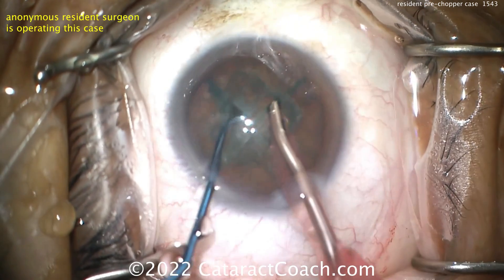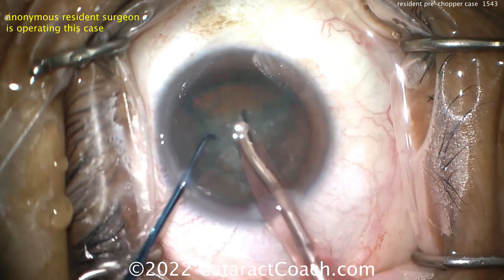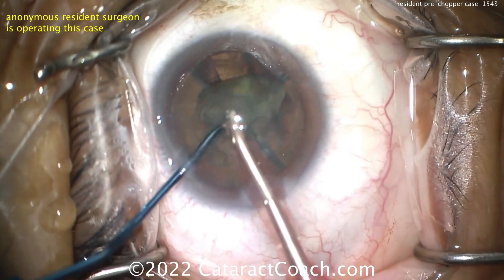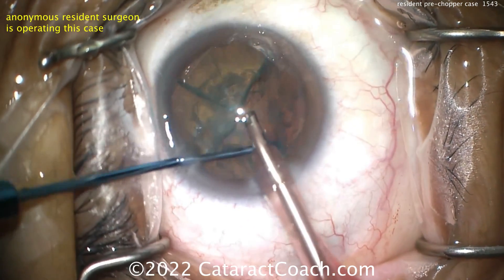The small CCC is going to make that a little more challenging — that's why that one quadrant didn't want to come out. Try again on the next one — bring it up. There it is: once it clears the CCC edge, it's easy. After the first quadrant is out, there's more room for the other three quadrants in the bag.